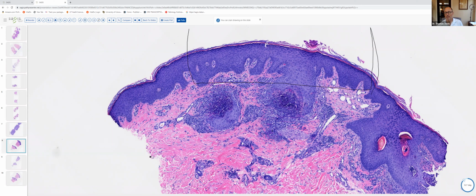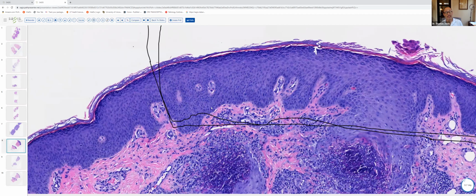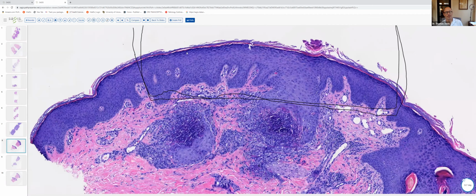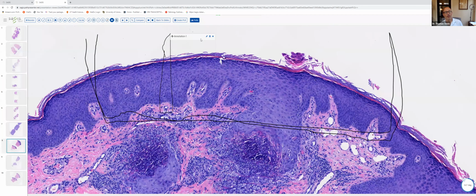So it tends to be kind of broader, not so much cup-shaped, extending from the base of the channel up to the surface, and mixed with neutrophils, one will see transepidermal elimination of collagen fibers, which tend to be a little bit thicker, more variable in size than these bulky refractile elastic fibers. And a lot of times they can be either eosinophilic or basophilic.